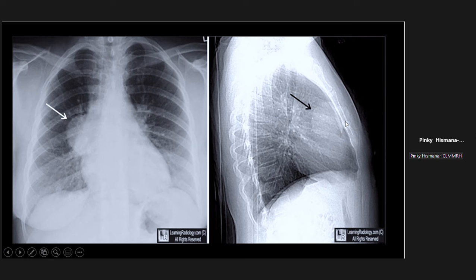Some doctors, especially the elderly, current doctors, usually would request only a PA or AP view. One reason would be to minimize the radiation to the patient, as well as the cost, and just for initial screening. But some, especially the long-practicing doctors or physicians, especially if they have a high degree of suspicion of cardiac or pulmonary pathology, right there and then request for PA and lateral view.